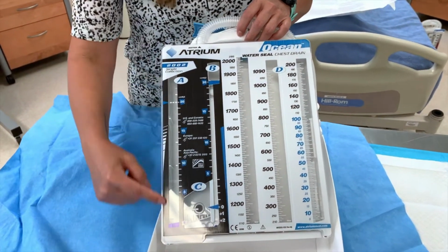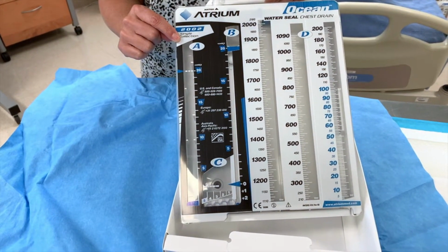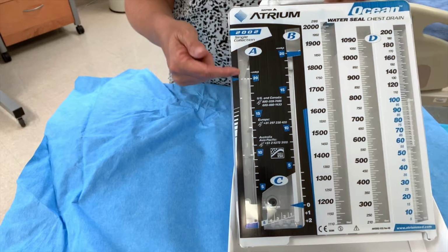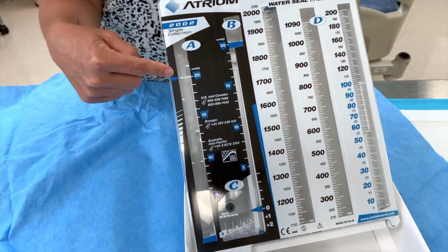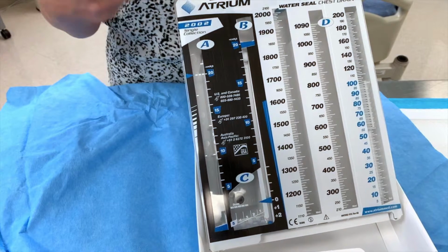On the far left chamber over here, we have our suction control chamber. In the suction control chamber, this is where you are going to instill sterile water to a certain prescribed level, and that prescribed level is normally 20 centimeters of H2O. That's the one where you'll be monitoring for continuous gentle bubbling.